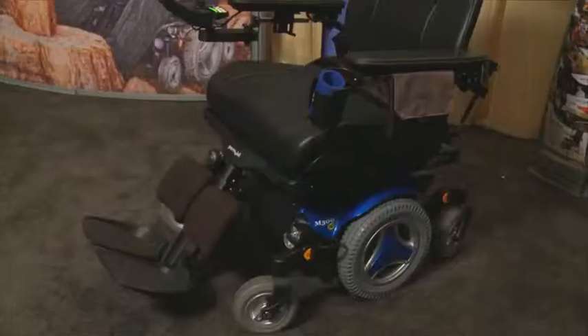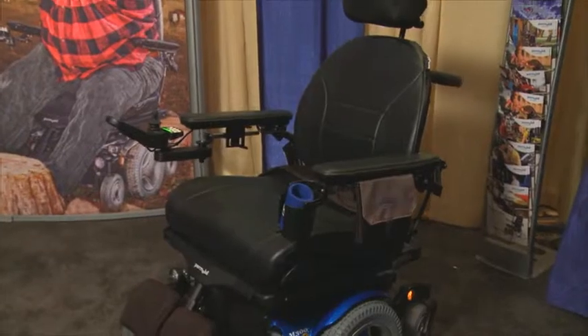My name is Todd Novak. I'm with Permobil. I'm the local Houston representative for Permobil and today I wanted to talk to you about the new heavy-duty chair from Permobil, the M300 heavy-duty.